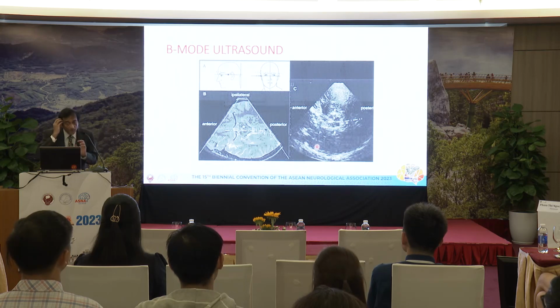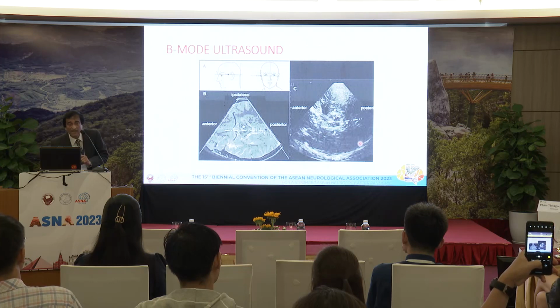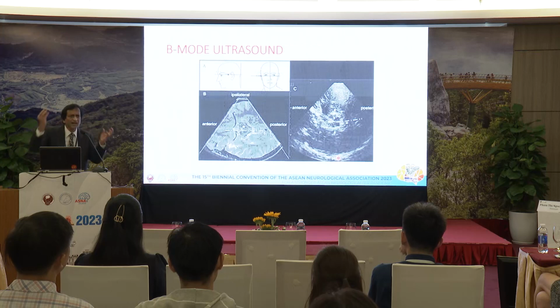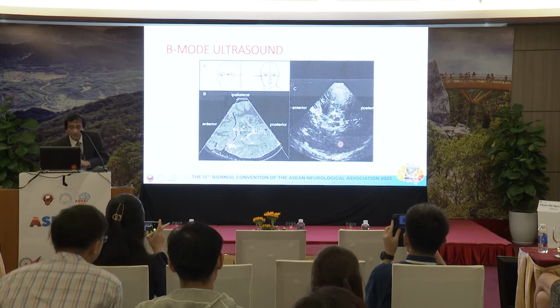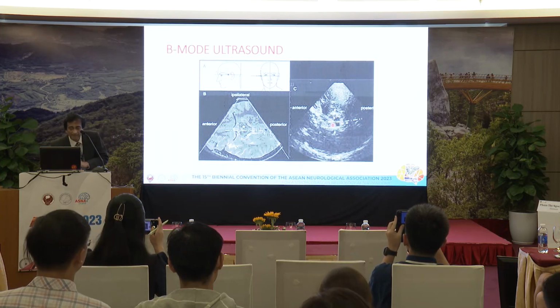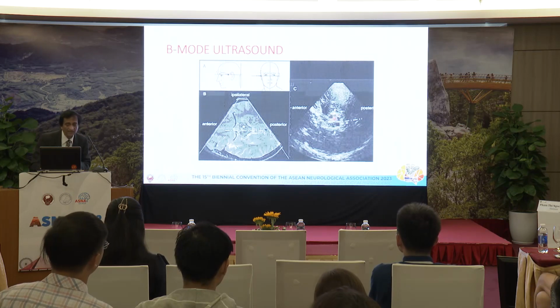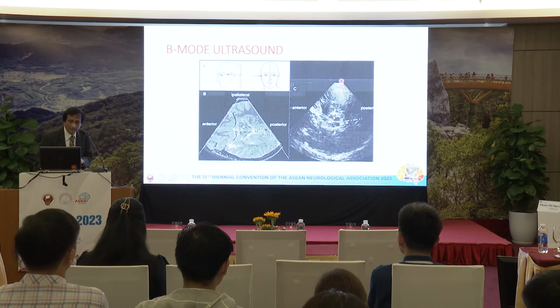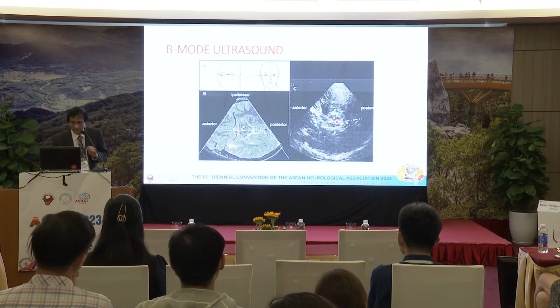Having put the probe on, you then increase the depth, still you see the skull on the other side. You must come to this, and this is a very bright structure. It's usually 15 centimeters in adults. And between is this beautiful butterfly, the midbrain, the cerebral peduncle itself, and then the midbrain, usually at 7 to 8 centimeters from the probe. The probe is here, the other side of the skull is here. You're then seeing the beautiful midbrain just about there.